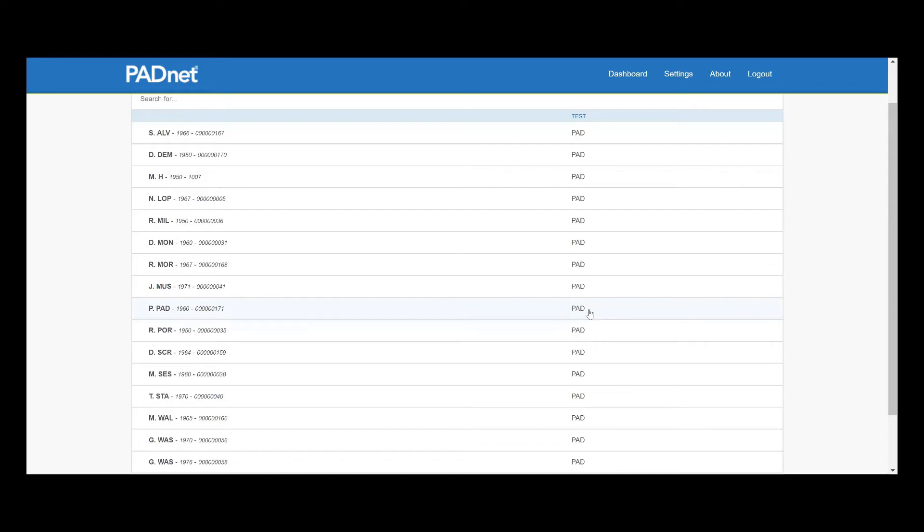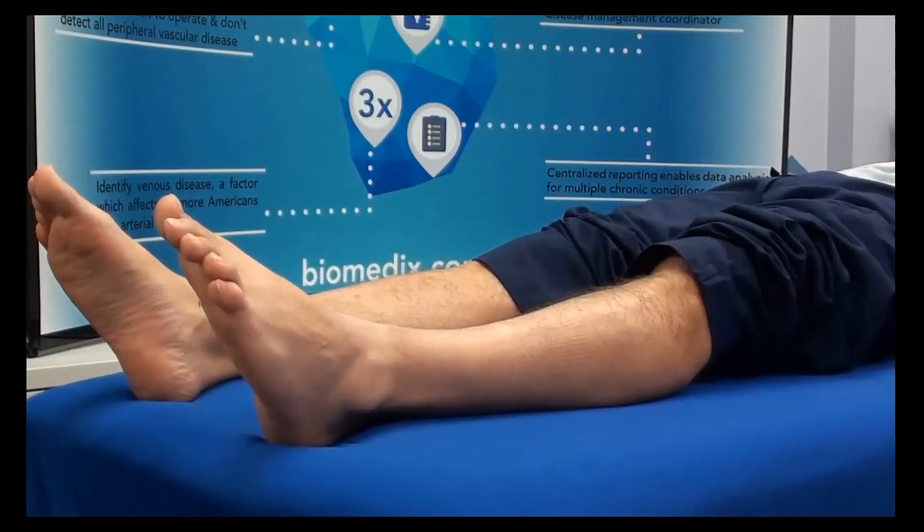Now before we click on their name, we want to make sure the cuffs are on, because clicking on their name will calibrate the pressure sensor, and we want to wait until the patient is ready to go.